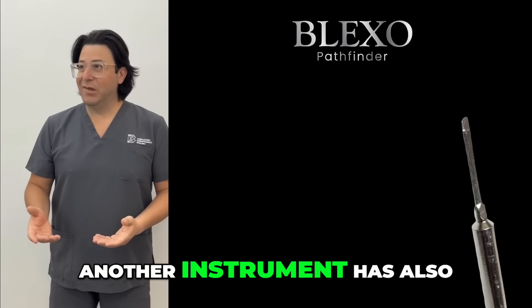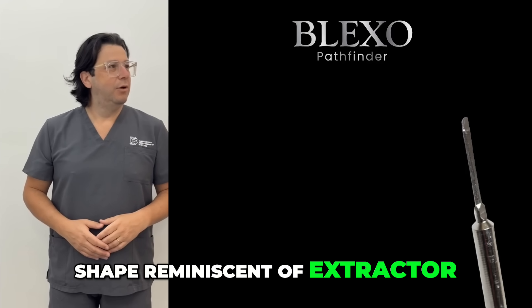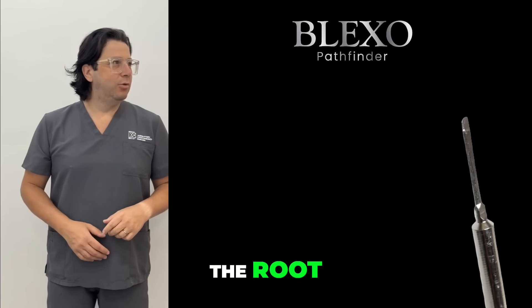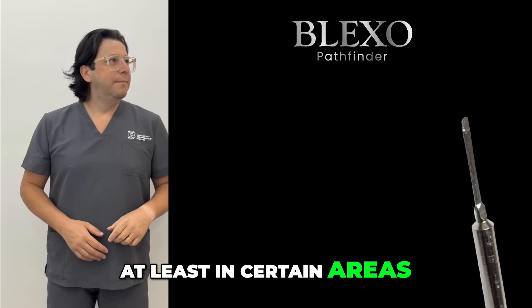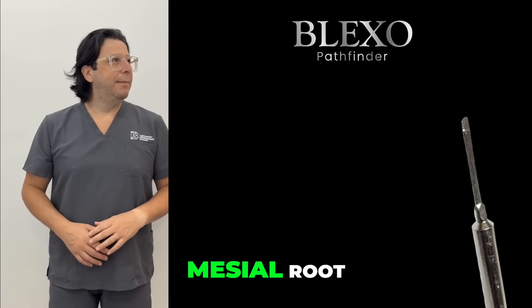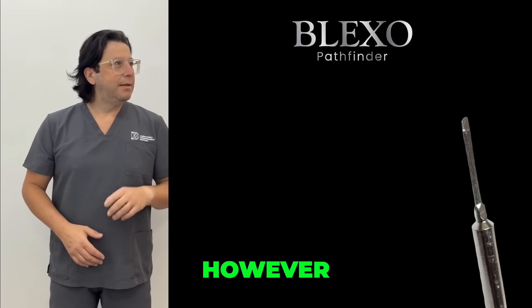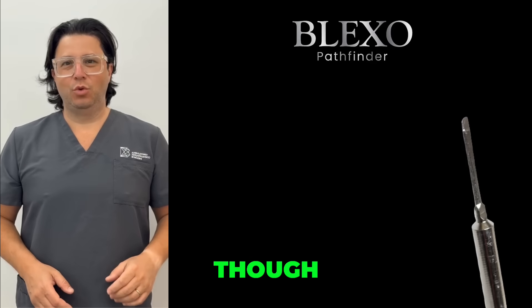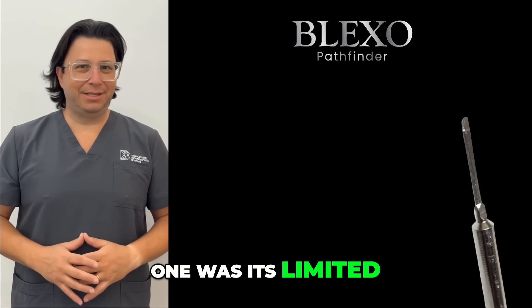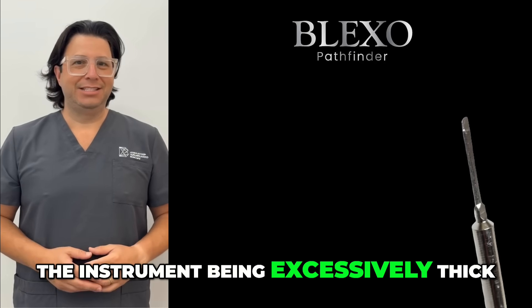In addition, another instrument has been created, still with a triangular shape reminiscent of extractor number one, for all those teeth that have a generally flat surface on the root, at least in certain areas. For example, this can be the case with lower molars, which normally have, at least on the mesial root, a flat surface at the interproximal level. However, the problem that sometimes occurred with extractor number one was its limited ability for the tip to penetrate, due to the instrument being excessively thick.